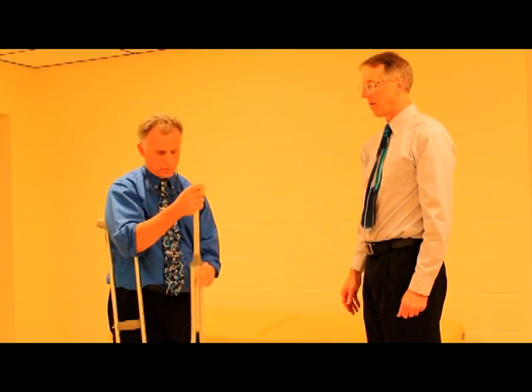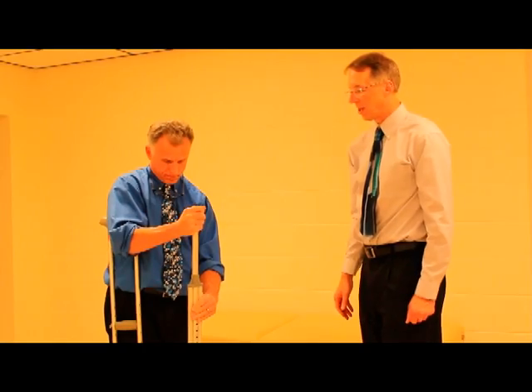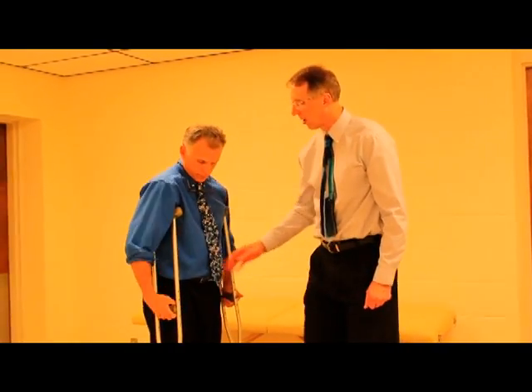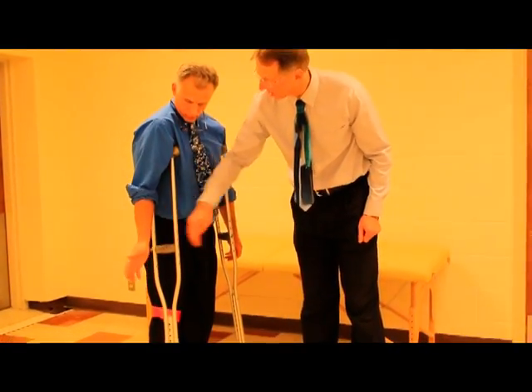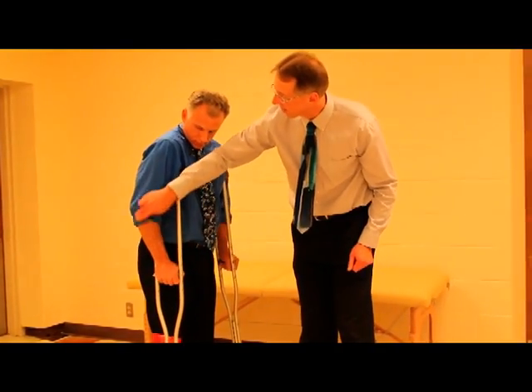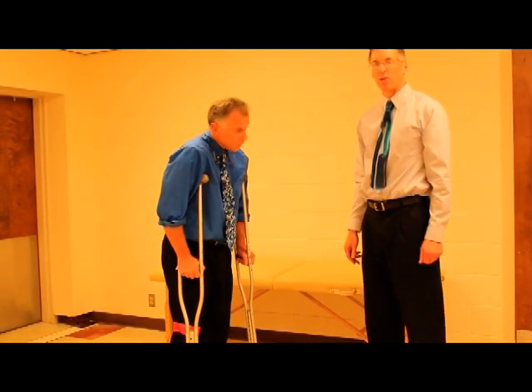Okay, so once you have the height set, then you want to make sure the wrist is set correctly. Now you're going to go ahead and see where your wrist falls — and again, his hits right along on the wrist where it's supposed to hit. When he puts his palm on there, you're going to have a slight bend to the elbow. That means you've set them up right.